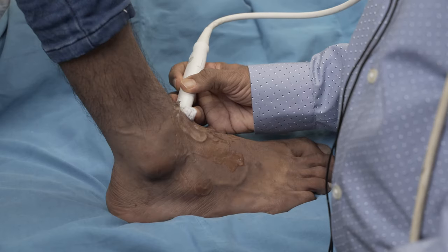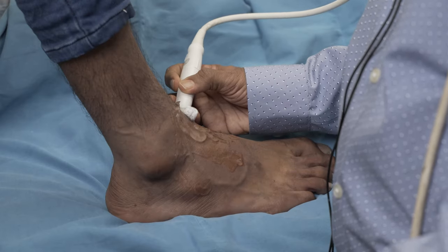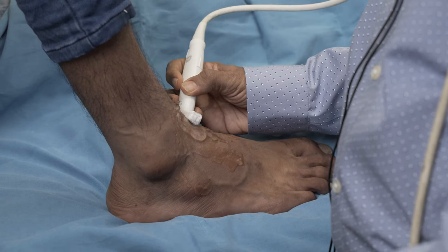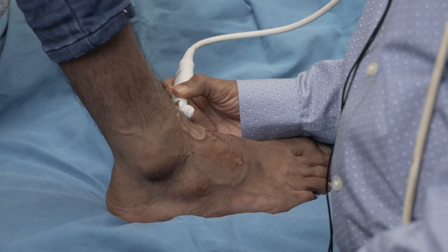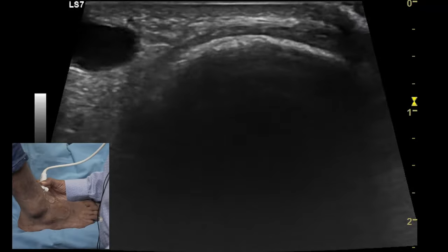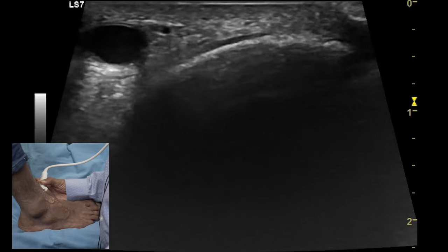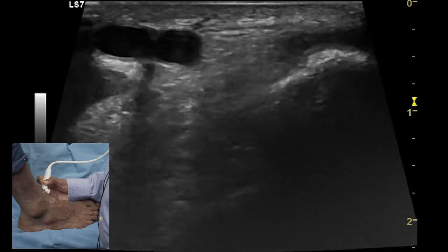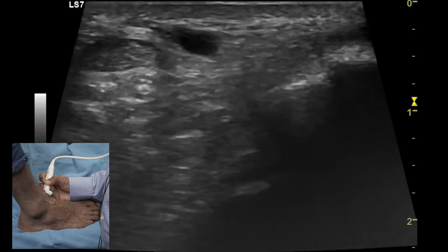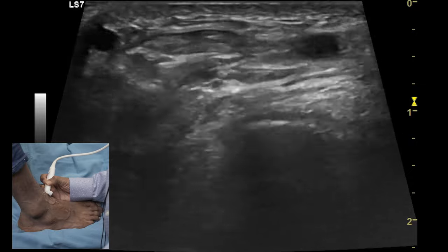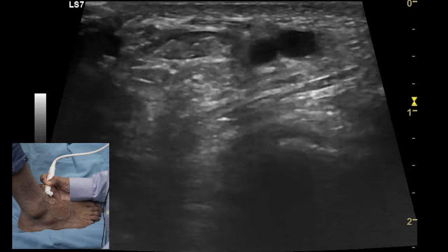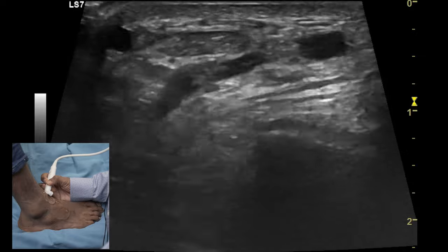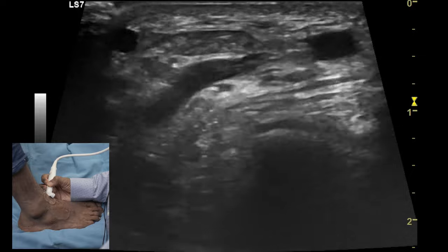Once the anterior tibiotalar joint space is evaluated, the next step is to look at the extensor tendons of the ankle joint on the anterior quadrant. By using the bony acoustic landmark of the medial malleolus, which appears as a hyperechoic structure, one needs to move the transducer laterally. The first tendon visualized in the transverse plane is the tibialis anterior tendon, which has a classical speckled appearance on the transverse axis.